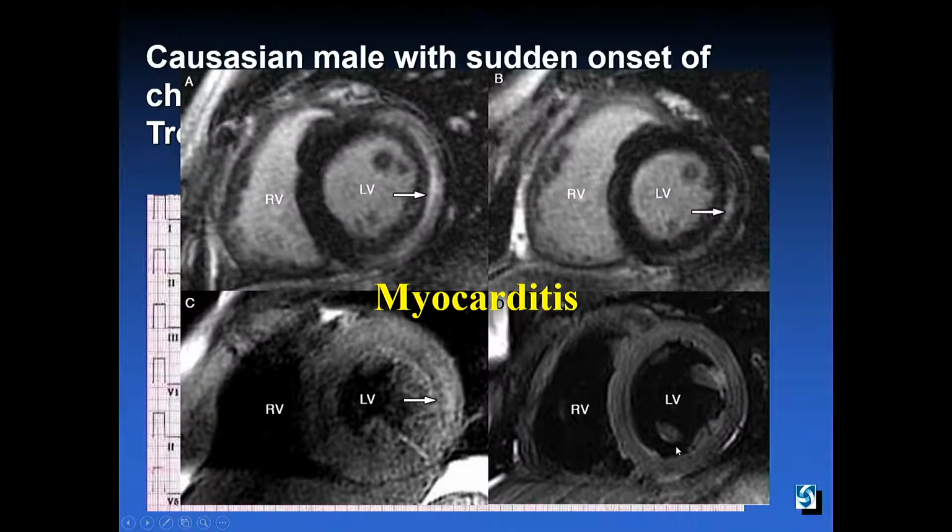About 6 months later, after verifying on MRI that he had myocarditis, he returned after a course of just supportive treatments. He wasn't given any steroids or anything like that. So, you can see that he still has a small residual scar, although the edematous, inflammatory region is by and large resolved. His left ventricle went from 30% back up to 50%, which was also predicted by MRI, as there was a lot of edema, so likely the LV function would improve, which is indeed the case.